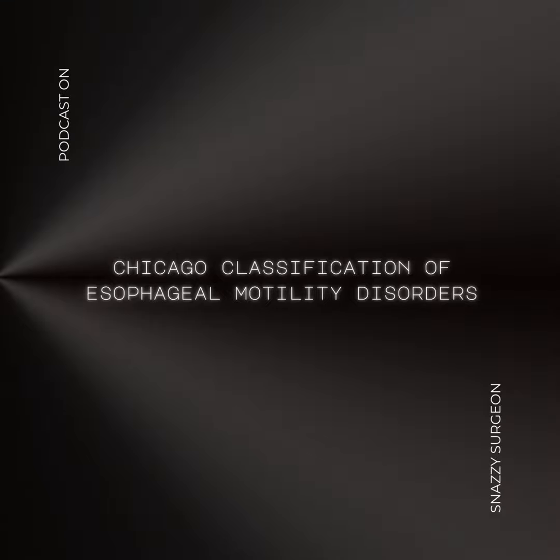That's the million-dollar question, right? So, manometry, with the Chicago classification as our guide, it's our go-to for diagnosing these motility disorders, no doubt. But we also need to remember that our patients don't always present in a textbook way. Their symptoms can be all over the map and often pretty vague. Like, you might have a patient with hypercontractile esophagus who just comes in complaining of chest pain, which could be caused by a million different things. Exactly. Symptoms don't always fit neatly into those categories.